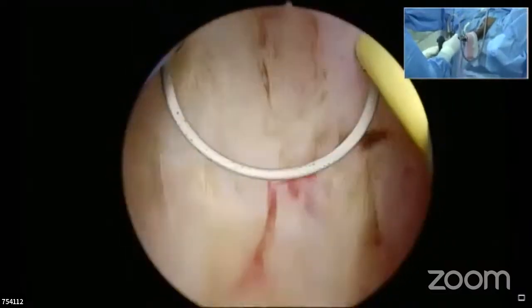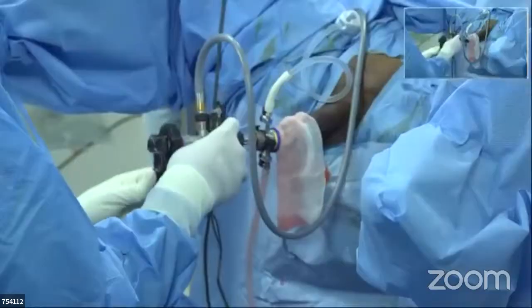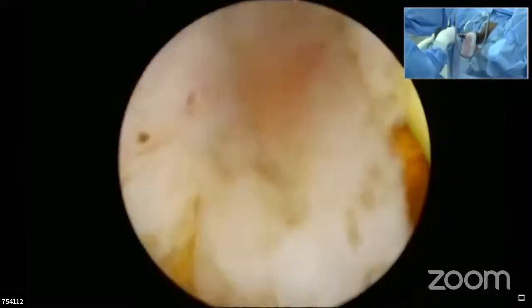Endoscopy. Take off. We're getting it, sir. We are getting endoscopic. Yes. All right. Yeah, we are seeing it. Let's try to talk.